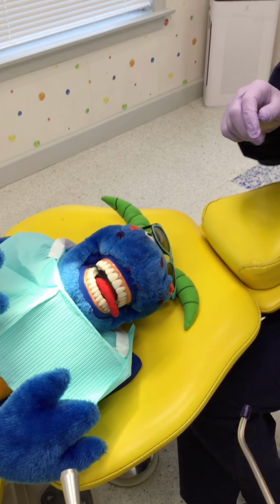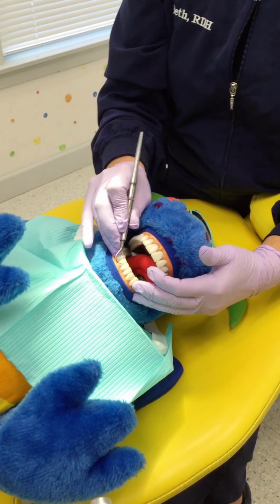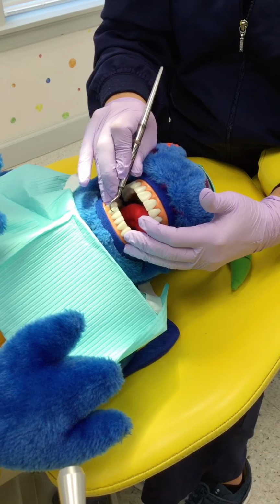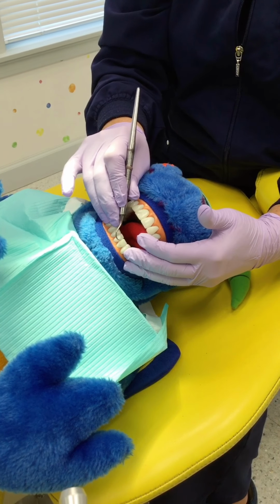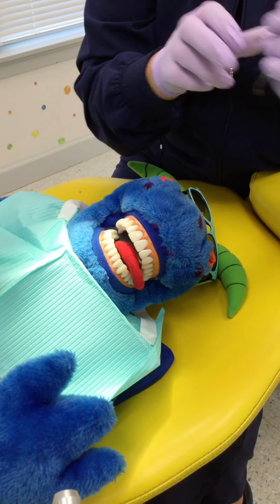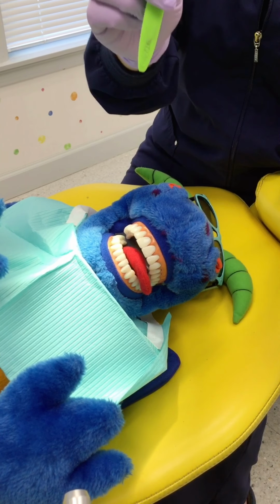With my tooth cleaner, the one that I showed you, the one that's a little bit bigger, this one actually slides next to the teeth. So it can go sliding up and down, making sure that, like I said, no sugar bug germs are sitting around next to those teeth anywhere. After we make sure that those are all clean like that, we would go through with a new toothbrush.